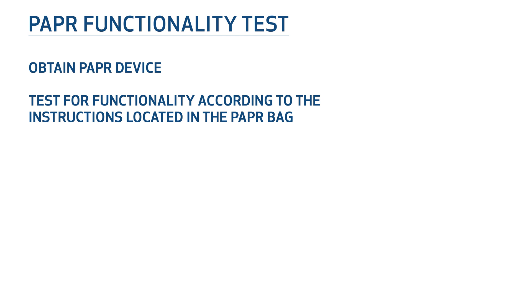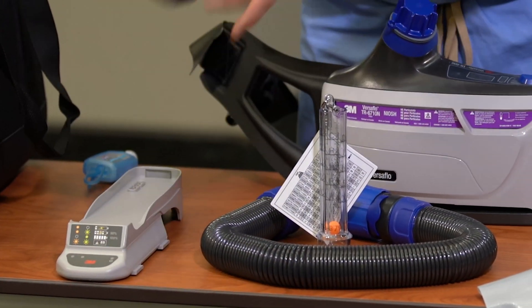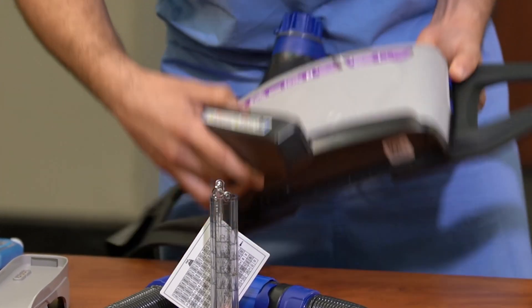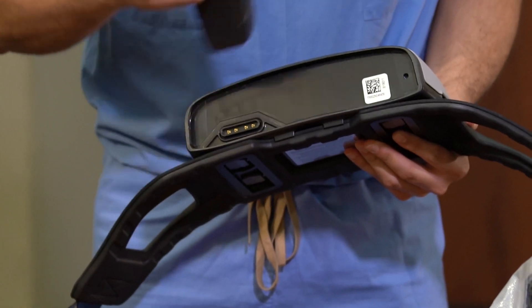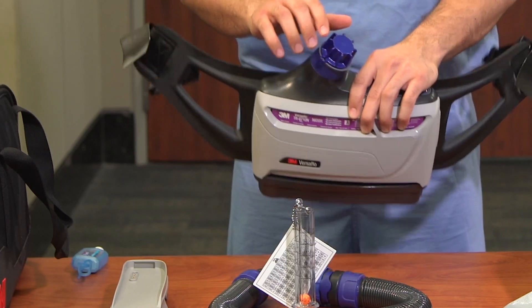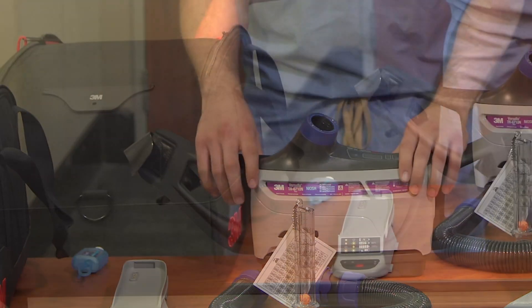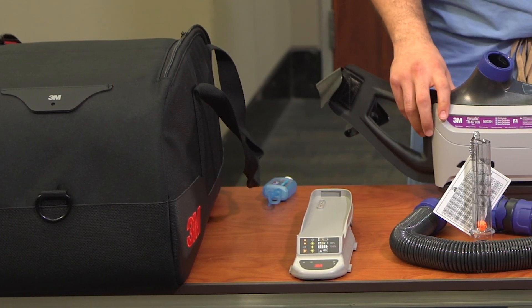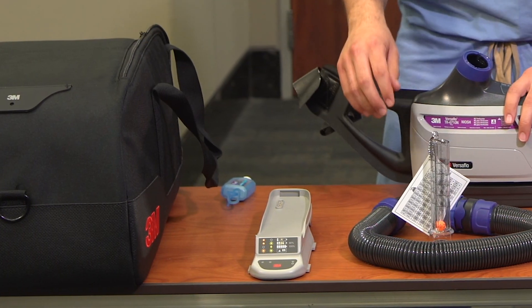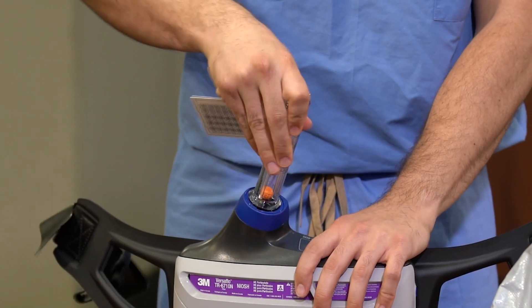Obtain the PAPR device and test for functionality. Remove the fan assembly from the PAPR bag and insert the battery at the bottom part of the device. Remove the protective covering from the airflow port located at the top of the device and place the cover back in the bag. Remove the accessory Ziploc bag from the storage pouch located in the center of the bag and retrieve the airflow meter. Attach the meter to the airflow port.